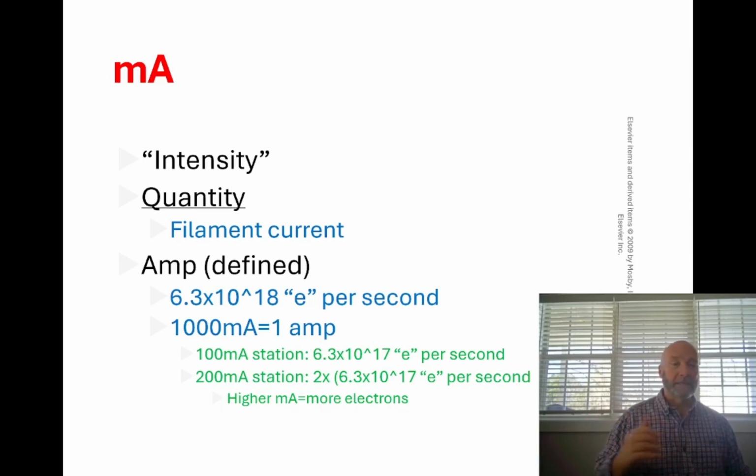It's unrectified, it doesn't need to be rectified, and we want low voltage, so it's going to go through a step down transformer so that our voltage is going to be between 15 and 25 volts, so that the electrons don't travel across the tube before we're ready for them to. So when we adjust our MA, what we're doing is we're adjusting how many electrons we can stack on a filament. So we've got a couple of things there. One is that the number of electrons we put on a filament directly correlates to how hot that filament's going to get. So when we hit the prep button, we turn on the rotor so that we spin it around and around, and at the same time we start to congest those electrons on that filament.